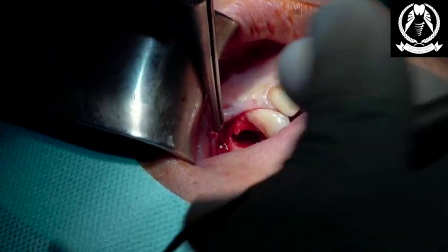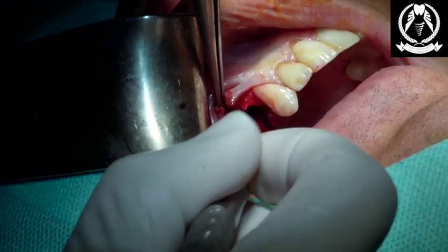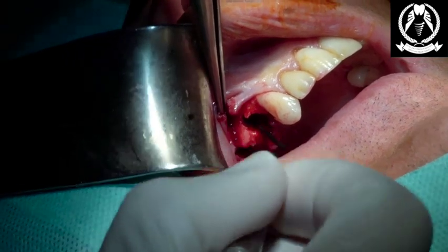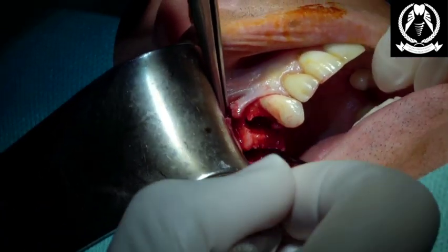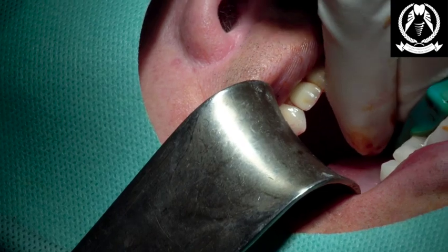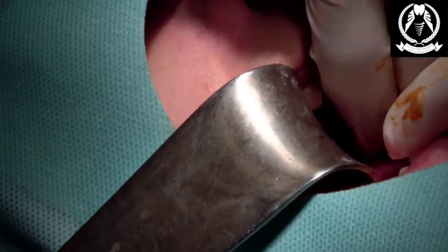Alan, if you could open a bit for me, buddy. How you doing? Yeah, good. Really good. Me too, I feel awesome. So we're just having a little feel, a little clean out of that socket. Job's a good one. Going 2.8 straight, drill extender. Just get me my drill. Okay, bit more. That's it.